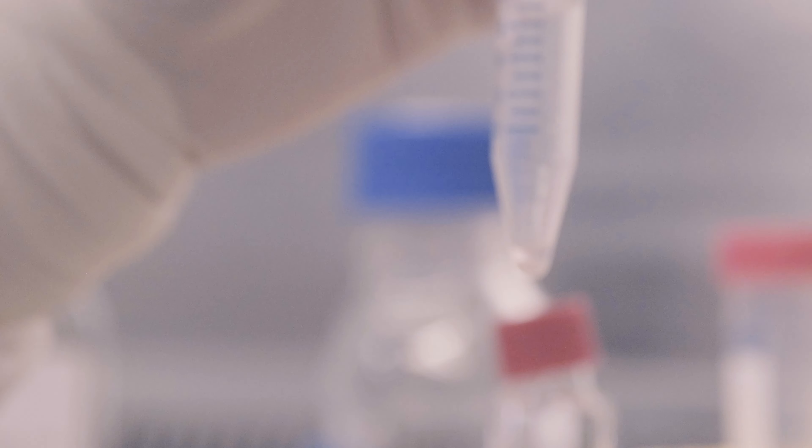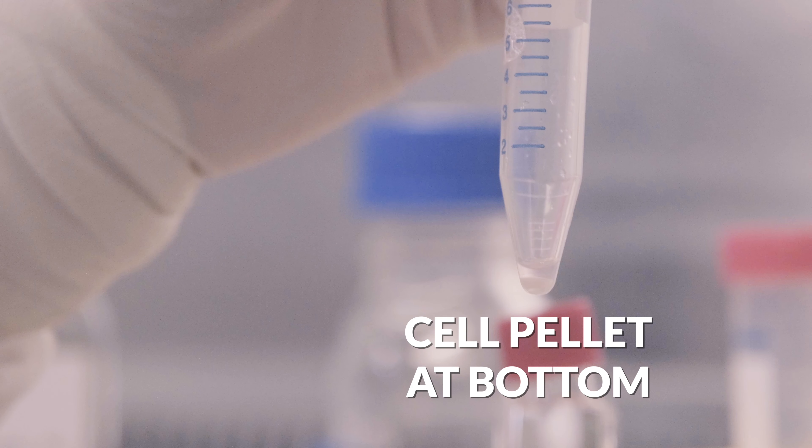Note that different volumes will require different pipettes. Larger volumes — 5, 10, or 25 mL — rely on motorized pipette controllers with single-use pipettes. Next, we will wash off any chemical cryoprotectant that may be toxic to the cells. Centrifuge the cells for 5 minutes; the cells are now pelleted down to the bottom.